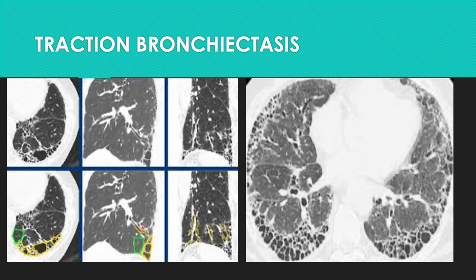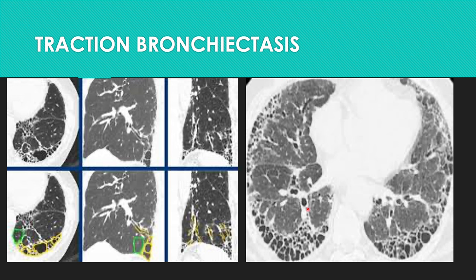Honeycombing is visible in the periphery along with dilated bronchi which are being pulled because of fibrosis. There is a lot of architectural distortion. Whenever there's fibrosis, not only are the bronchi and bronchioles pulled, but the pulmonary vessels are also pulled toward the fibrosis. So when we look at pulmonary fibrosis in UIP, we look at honeycombing, traction bronchiectasis, and all the architectural distortion. I will be doing a separate video on ILD patterns in much more detail.